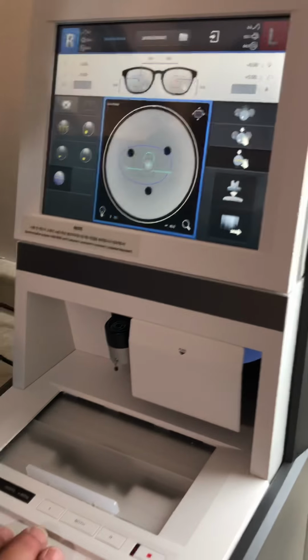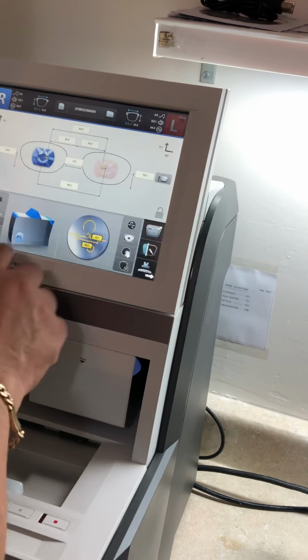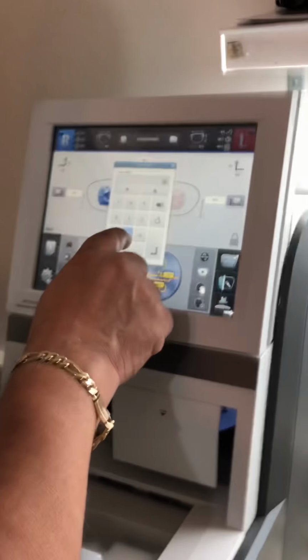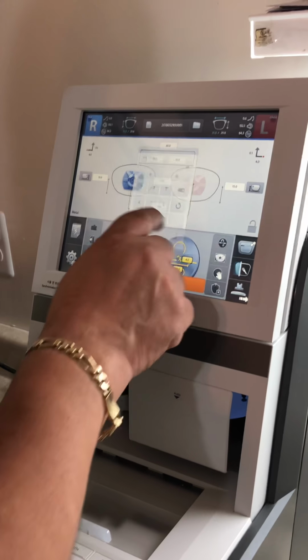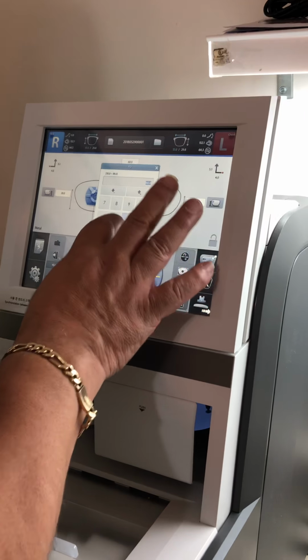Do you have one that's already been, one that we have like a junk lens and stuff? Whatever. This one. Well, it's not junk. Well, it doesn't make a difference. So we're just talking right now. Yeah. We're gonna drop something in there. Just want to get this guy a little bit wider.